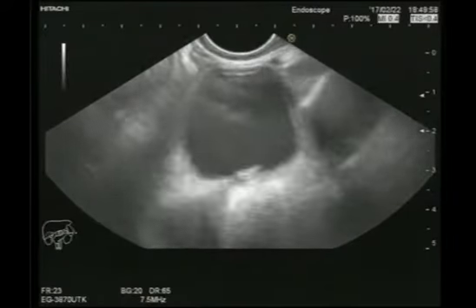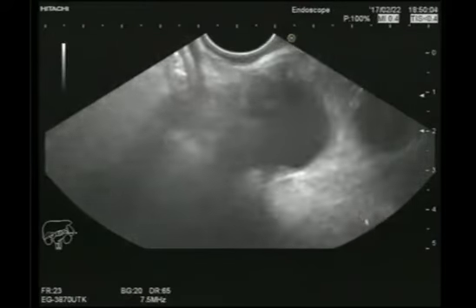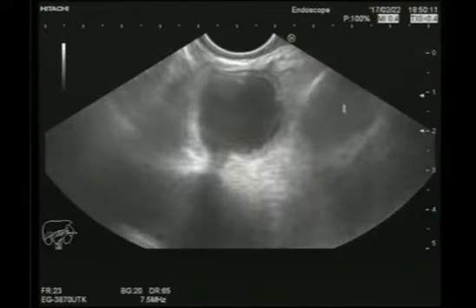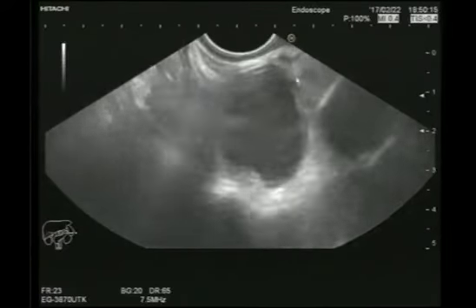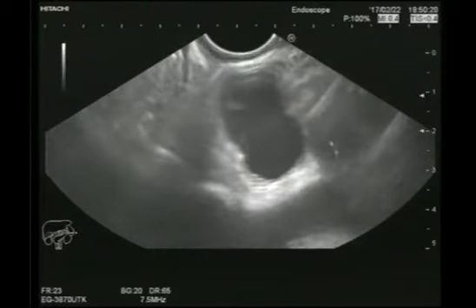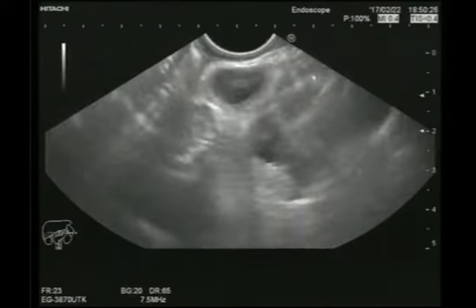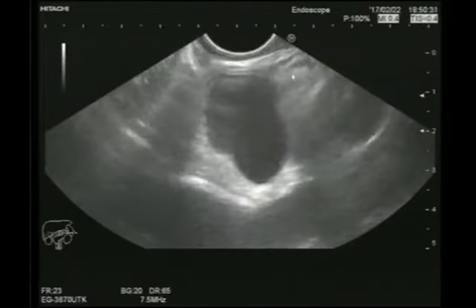Now we are at 28 centimeters, and Professor Okasha is showing you the left atrium and pulmonary artery, and in between them the so-called subcarina. The advantage of starting the examination from here is that there may be metastasis even to the subcarina in some types of peripapillary tumors, so it is better to start examination from the proximal in these cases.